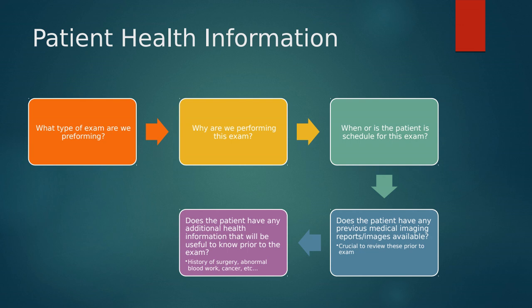MR terminology, CAT scan terminology, mammography terminology, they're all different than ours. So you have to be aware of what those key words are, because we are the ones who are usually providing secondary information. Those modalities are typically the first type of exams, or maybe they find something incidentally, and then we have to go in and provide further detail. So we can't rely on a machine to find it for us. We have to know where to be looking.